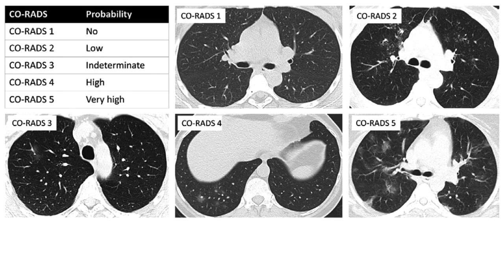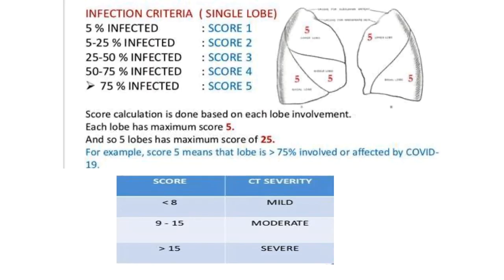CO-RADS 1 shows no lung involvement — completely normal. CO-RADS 2 shows few ground glass opacities near the cardiac shadow on the right side. CO-RADS 3 shows peripheral ground glass opacities on the right side. CO-RADS 4 is peripherally present, nearly subpleural in the posterior basal part. CO-RADS 5 shows multilobar bilateral ground glass opacities — very highly likely of COVID-19 pneumonia.